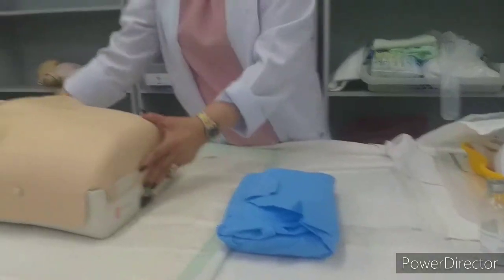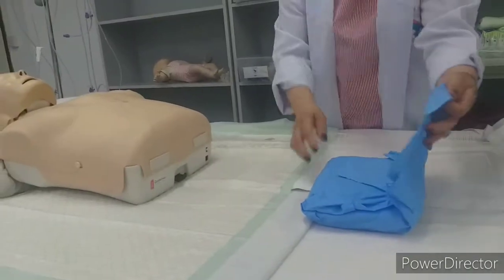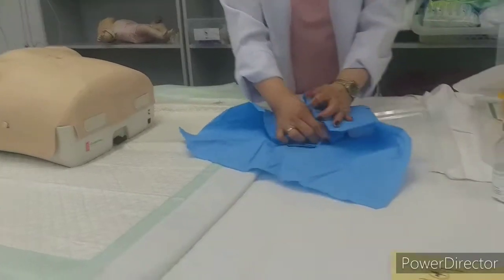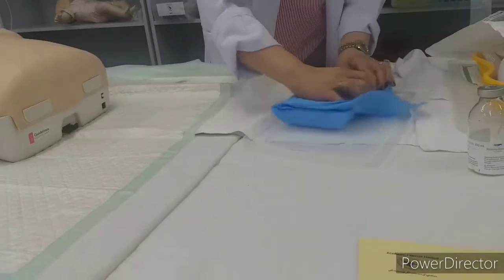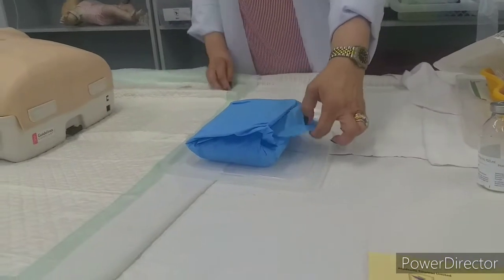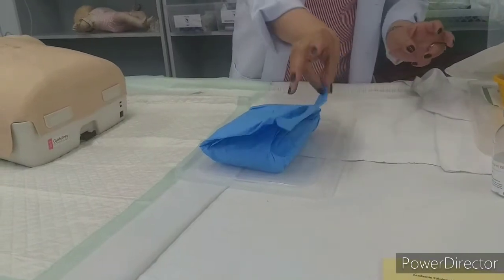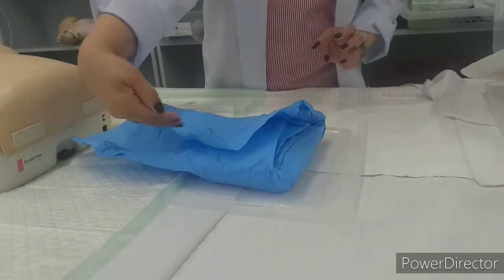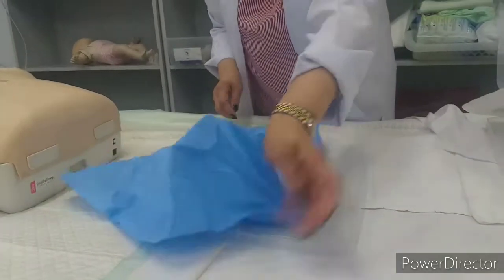When opening, wait a minute. Okay, so opening this, we have to hold the tip. There is a tip, or we call it a tongue. Okay, a tip here, open. So do not hold here. You will compromise the sterility from inside. Out, out, and out.